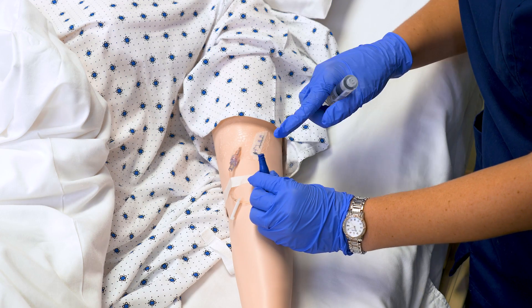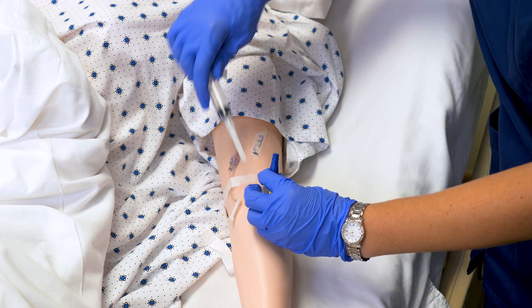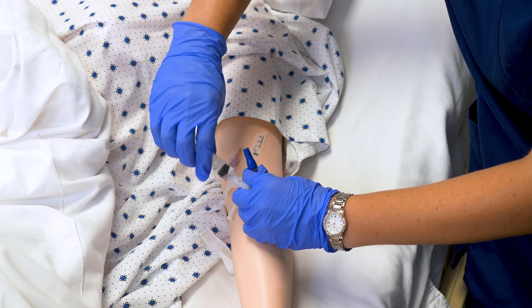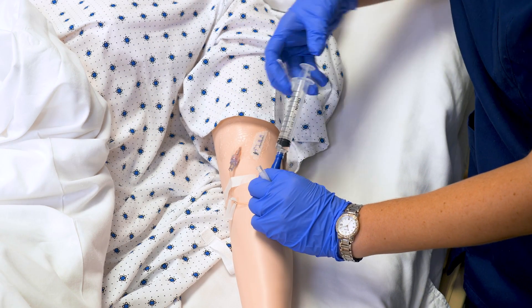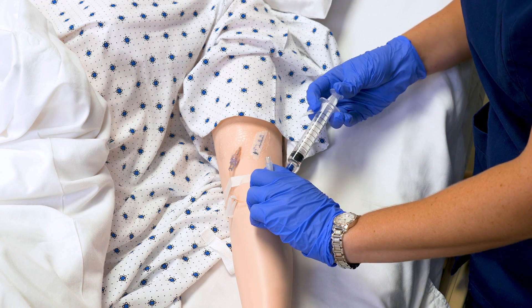Without touching the end of the needleless cannula, I'm going to switch my syringes. I will now administer my medication at the recommended rate. I'm giving one mL over one minute. You do need a watch with a second hand.